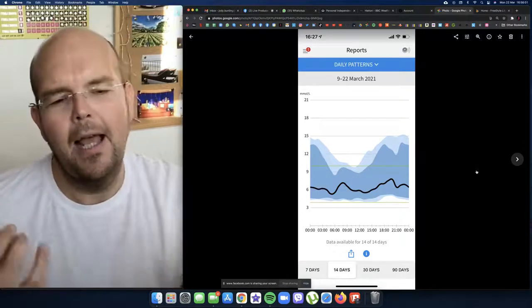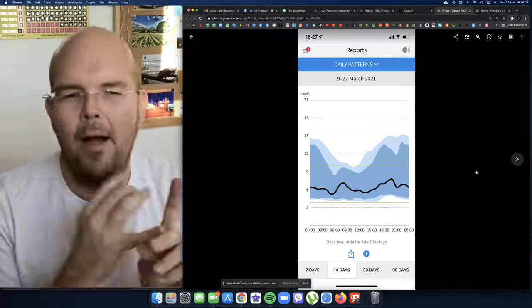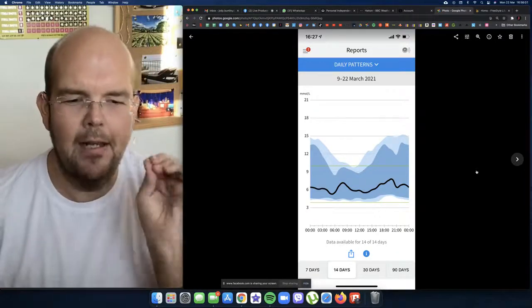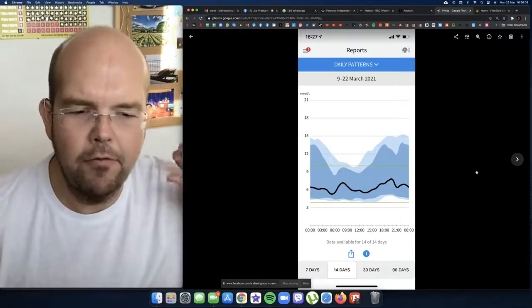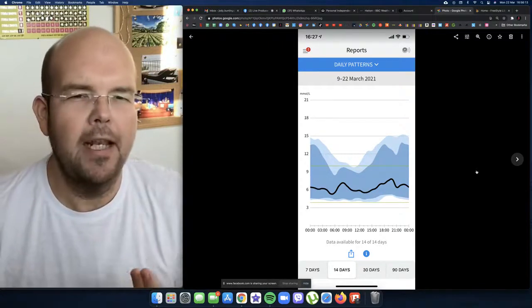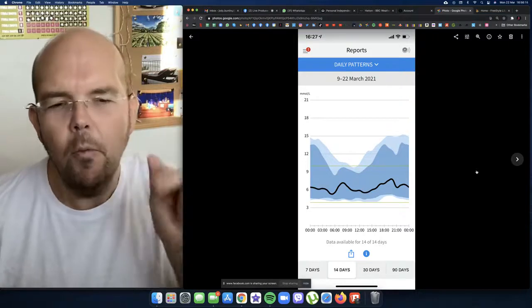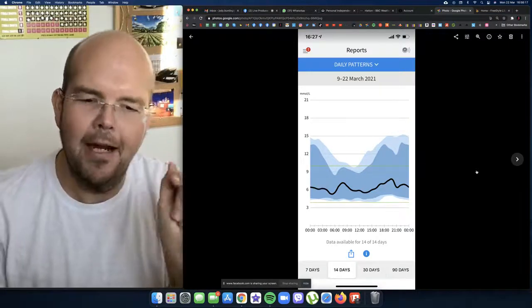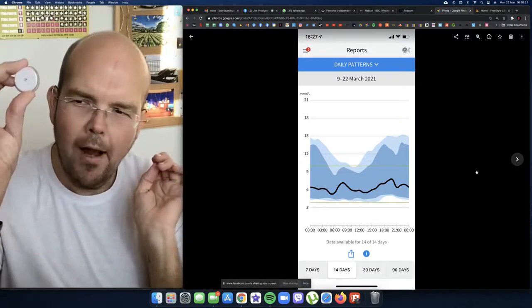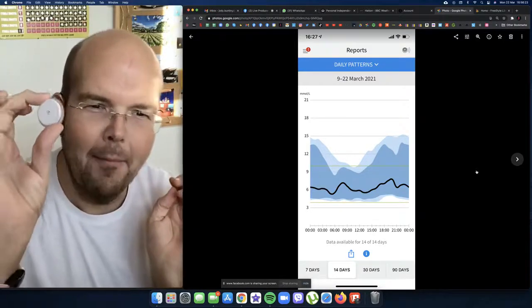For those of you that eat at 8pm or 9pm and wonder why you have interrupted sleep — this graph proves exactly why. If you can leave four hours before going to bed after your last meal, it's really going to help your blood sugar. I also find out through this device why I wake up at 4am most days.